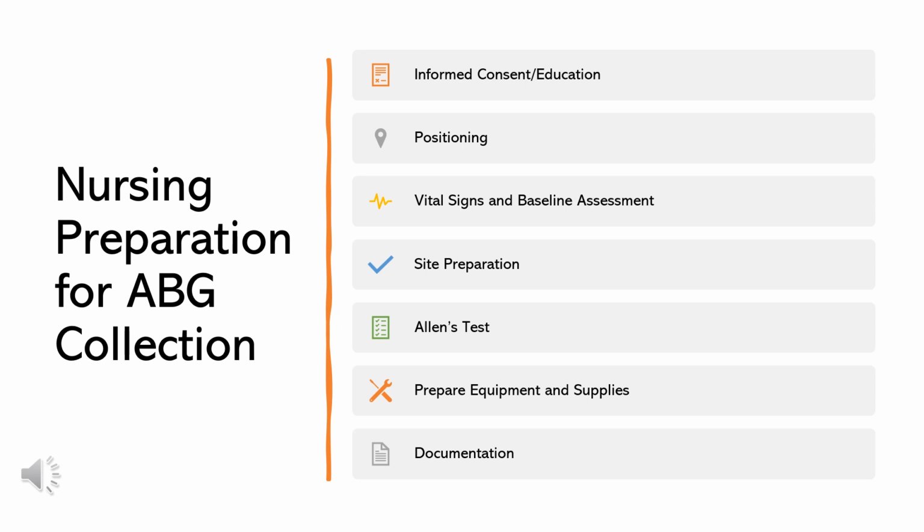Make sure to pass the antiseptic solution to the healthcare provider for site preparation, ensuring adherence to aseptic technique. While the healthcare provider performs Allen's test, assist as needed and observe to confirm collateral blood flow. You're also going to have to help with preparing the equipment supply.